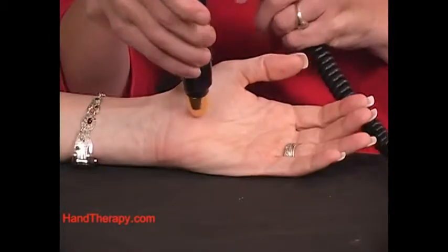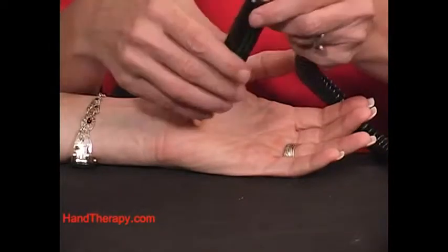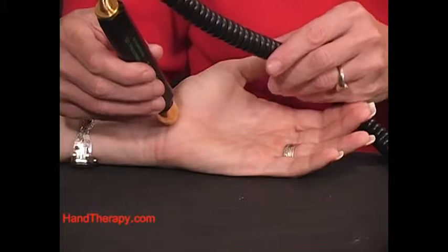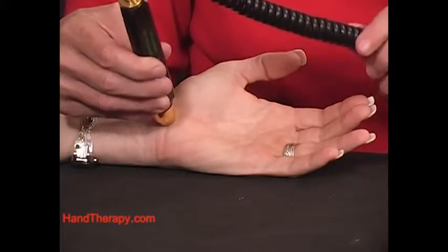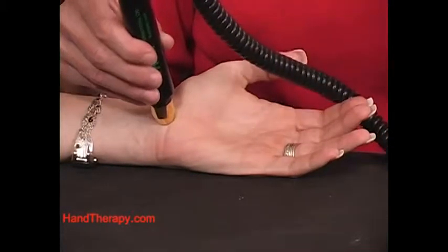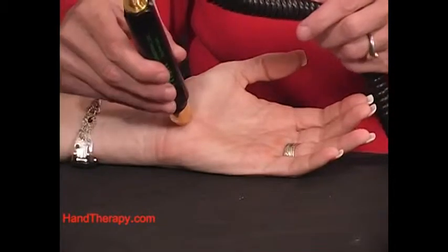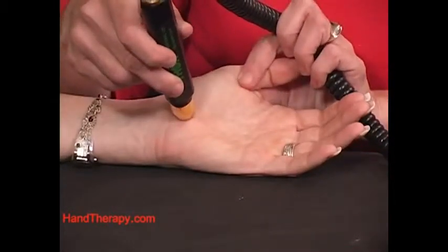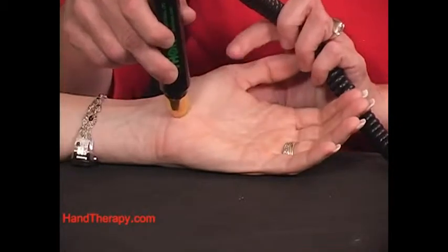And just for a moment, I'm going to show you close up the difference of a sweep versus a contact. So for the post-op pain with the carpal tunnel, I am going to treat as close to the wound as possible. If you can get contact, that would be good. And just let me show you, like I said, the different techniques. Contact would be actually making contact with the skin or the targeted area.